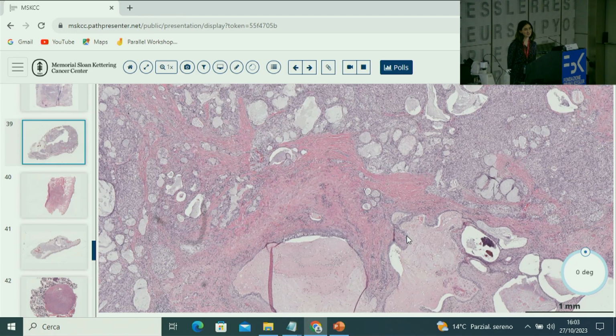Now I have a question, Nora. You said that P40 and P63 really have to be positive in mucoepidermoid carcinoma. Have you seen cases that you thought were mucoepidermoid by morphology or MAML2 that don't have P40 and P63? Because people lose that all the time. I have that problem. Sometimes you think about mucoepidermoid and you do the stains and it doesn't stain like mucoepidermoid.